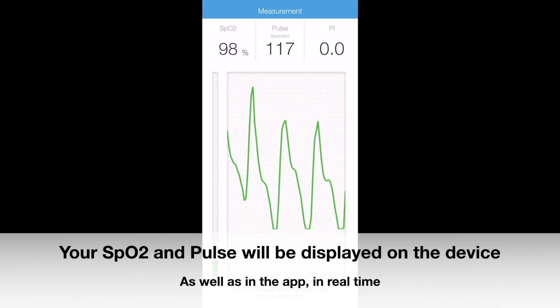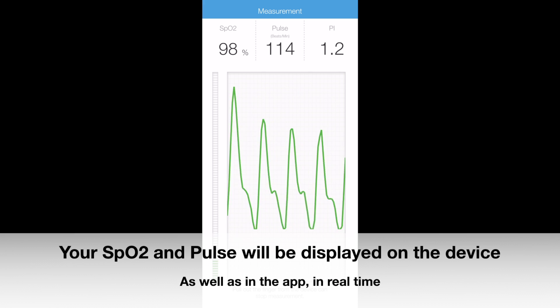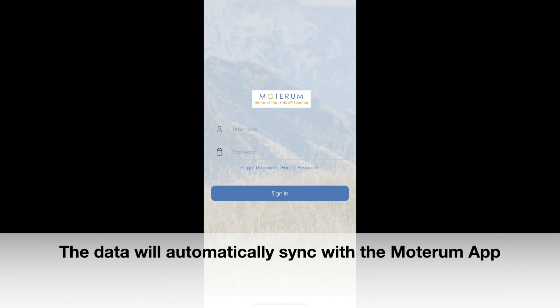Your blood oxygen level and pulse rate will be displayed on the device as well as in the iHealth app in real time. After the data from your measurement is automatically uploaded to iHealth My Vitals, it will automatically sync with the Moterum app.